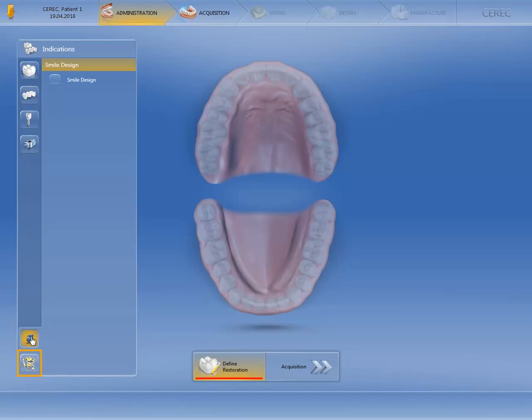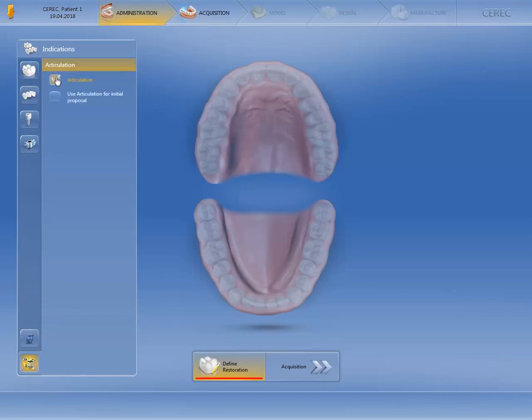Then, we will switch to the Virtual Articulator option. As with Smile Design, we have to activate the checkbox in order to calculate a restoration taking the data of a Virtual Articulator into consideration. Once the checkmark is set, you can also activate the option Use Articulation for Initial Proposal.